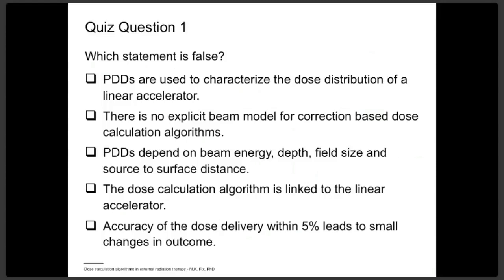All right, great. Looks like we've got one more question that just came in that we can address before we move on. What algorithm takes into account neutron production contamination at high energy? Those, to my knowledge, are only taken into account by Monte Carlo simulations, where you can simulate the interaction of nuclear processes explicitly, and so you can simulate the generation of neutrons. Typically, the contamination is at a very, very low level, so you need to look at the 1% level of accuracy, or even below, if you want to take them into account.